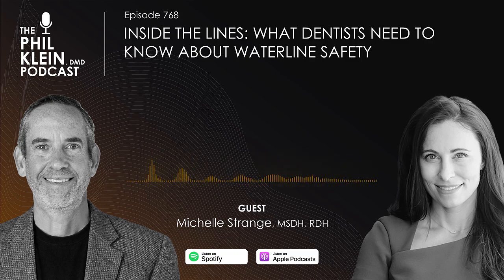And I assume when you shock, you're kind of tying up the operatory, are you not? A shock can take up an operatory depending on when you're doing it. A lot of them will be overnight sits. So if you're doing it in the morning, it might take up your operatory, or you just do it in the evening, or everybody tackles it on the 15th of the month, whatever it is, right?